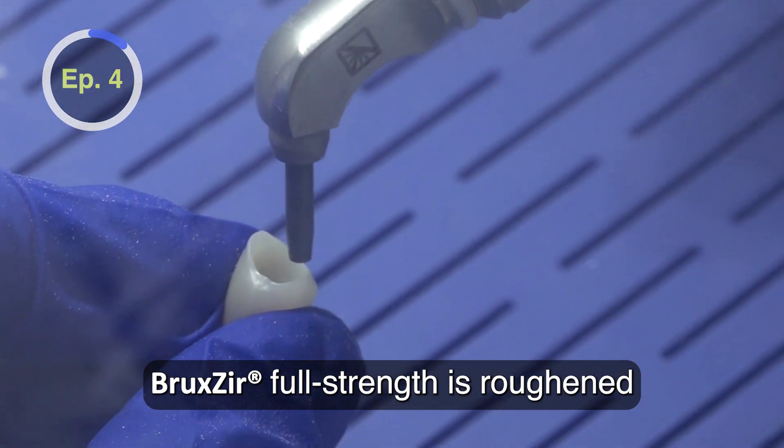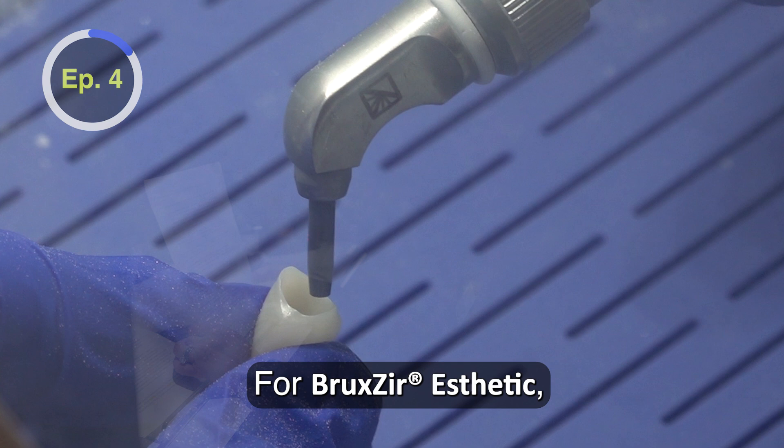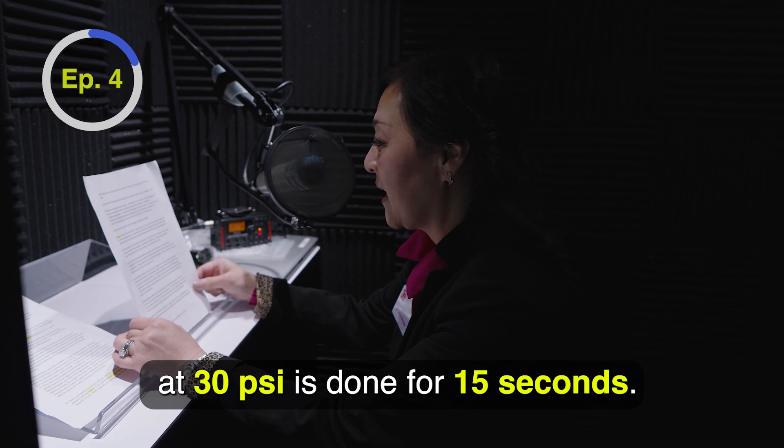Bruxer full strength is roughened by blasting 50 microns of aluminum oxide for 15 seconds. For Bruxer Aesthetic, 30 microns of 3M Co-Jet at 30 PSI is done for 15 seconds.